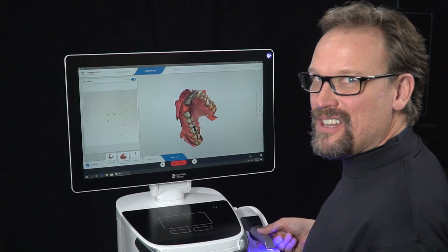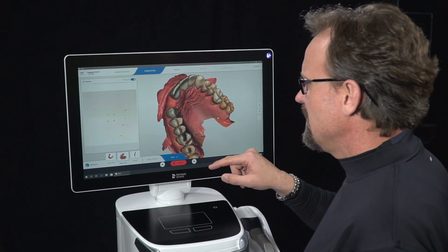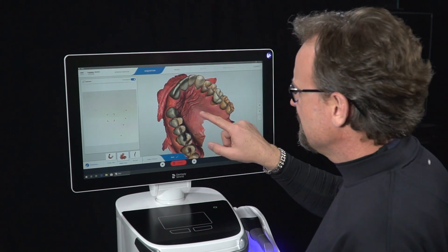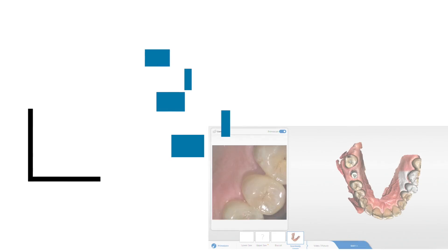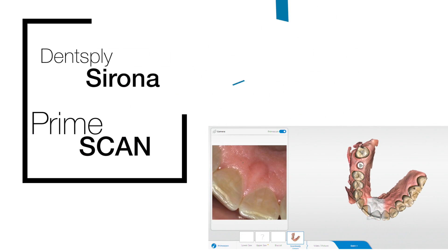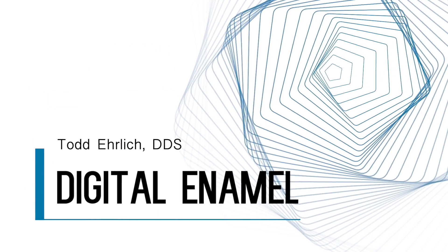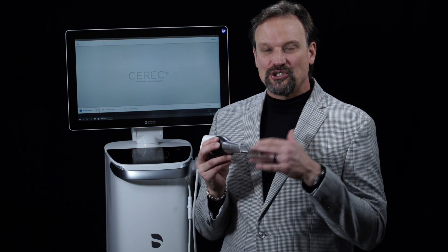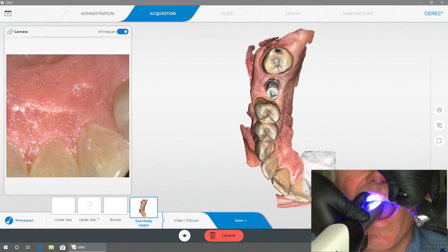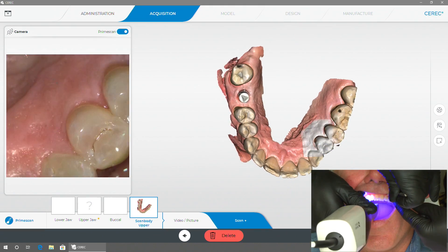Just scanning with the Prime Scan. The Prime Scan is awesome — it is so fast and so accurate, it's going to knock your socks off. There's no camera as fast as this and as accurate as this.